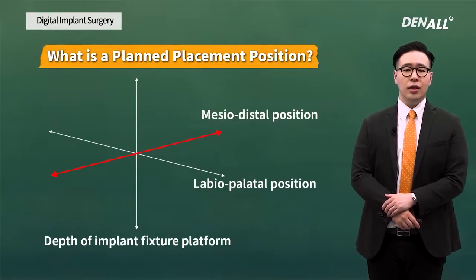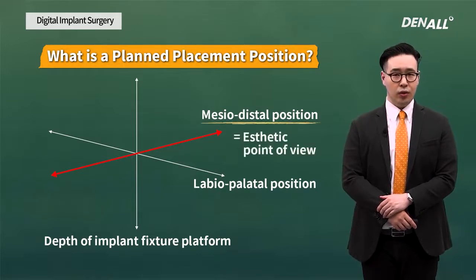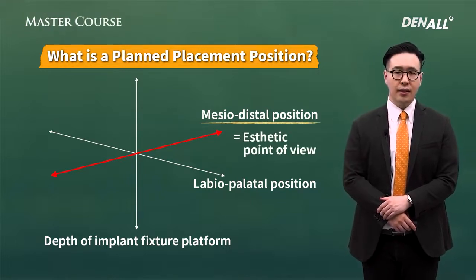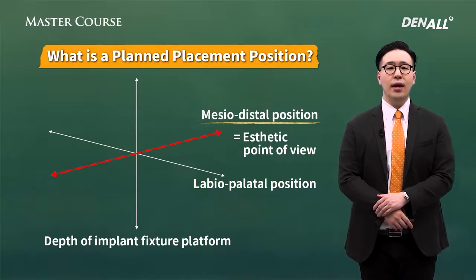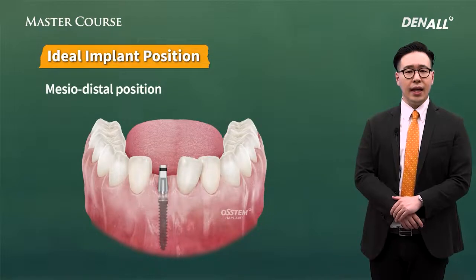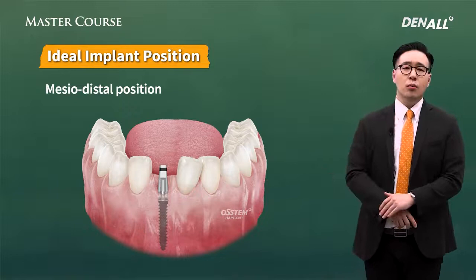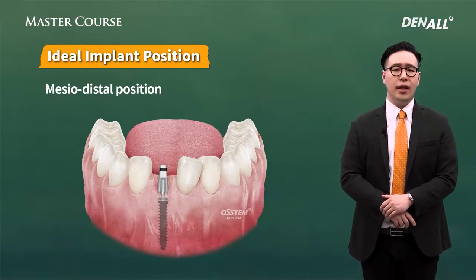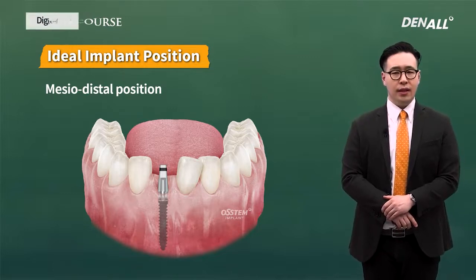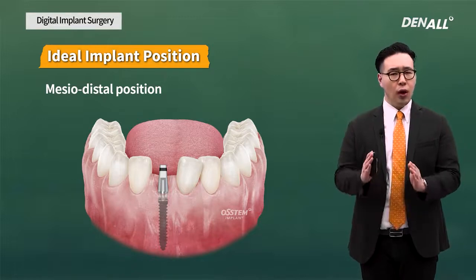Next, accuracy of mesiodistal implant positions can affect aesthetic factors. When many implants need to be placed, the distance between the implants affects the implant's long-term survival. The narrowest space for implant placement can be found in the lower anterior region. In most of the cases, one-body narrow-type implants are selected. Osstem's one-guide system is very helpful in placing narrow implants accurately using the 1MS kit.